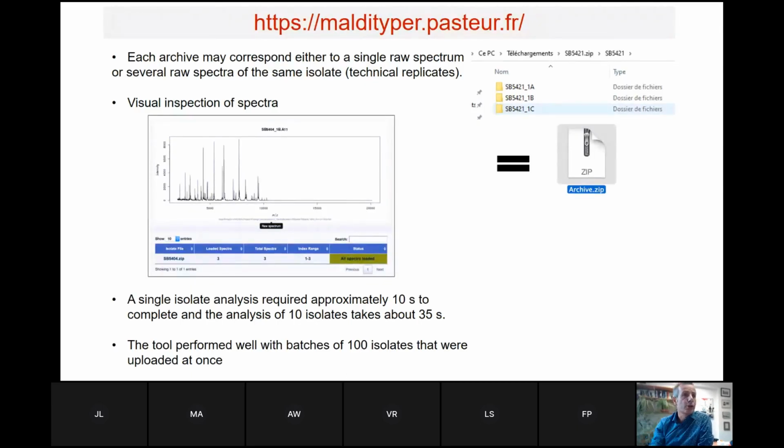Before that, I will just mention some of the principles, which are quite obvious, in fact. The first step is obviously to look for the spectral folders, which are in your Bruker. In this case, we use Bruker data only, in your Bruker apparatus, or the computer attached to the Bruker apparatus, at least. And the first step is we introduced a step to visualize spectra, just to make sure they are correct and good quality, and to get a feel of them if necessary.